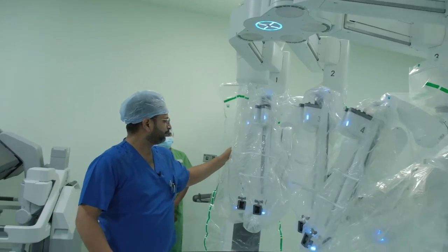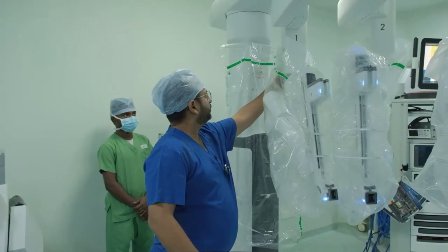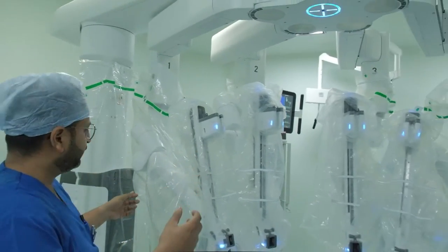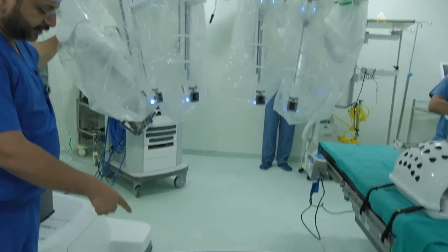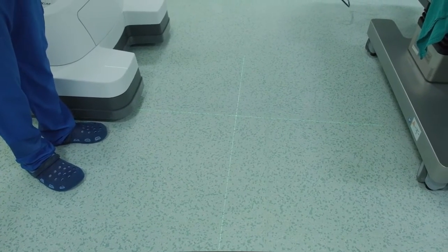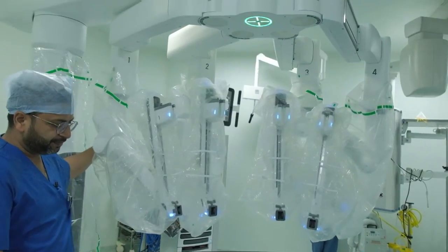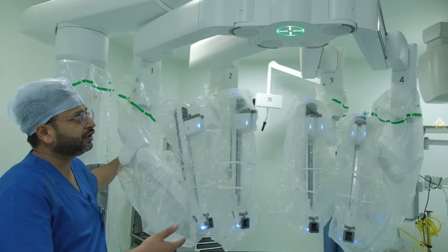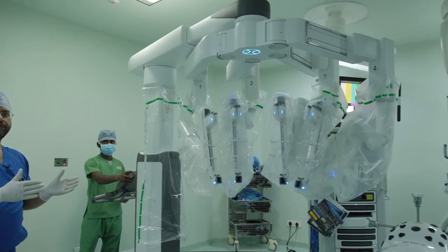If I press the boom rotation button here, we'll see the laser light, and so you can see the laser light, and what the robot is asking us is to take this to the endoscope. Now we are going to push the patient cart to take this to the endoscope. So now we are going to stow the patient cart.